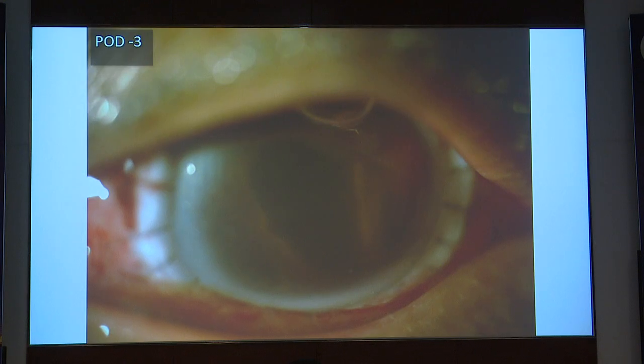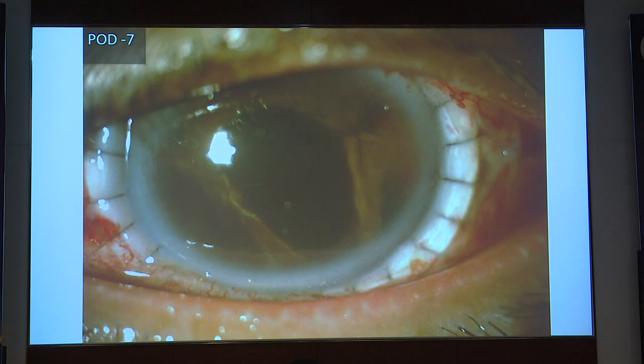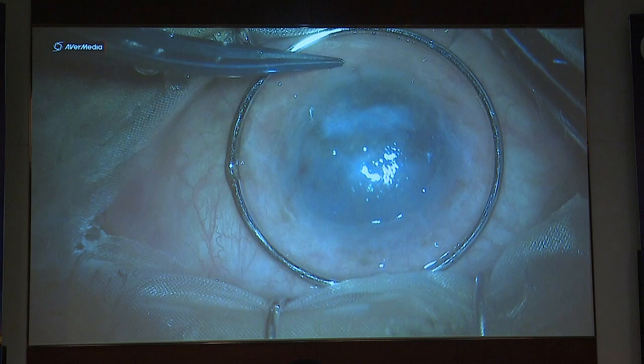So this is at day 3. Quite a lot of haze because of the hyphema. And this is at day 7. PR was inaccurate because of long-standing high IOP, but nevertheless, cosmetic result was good.